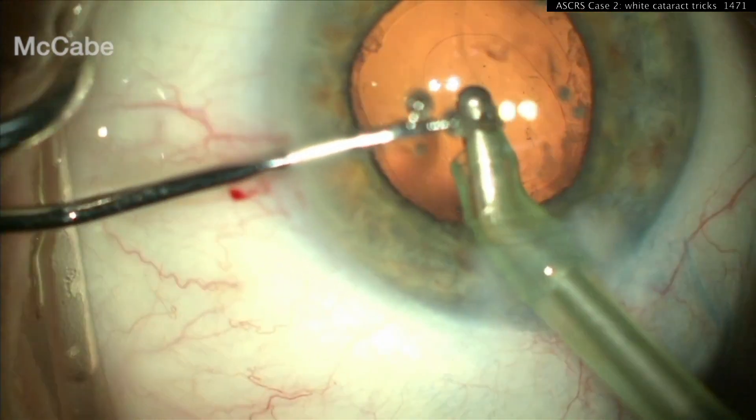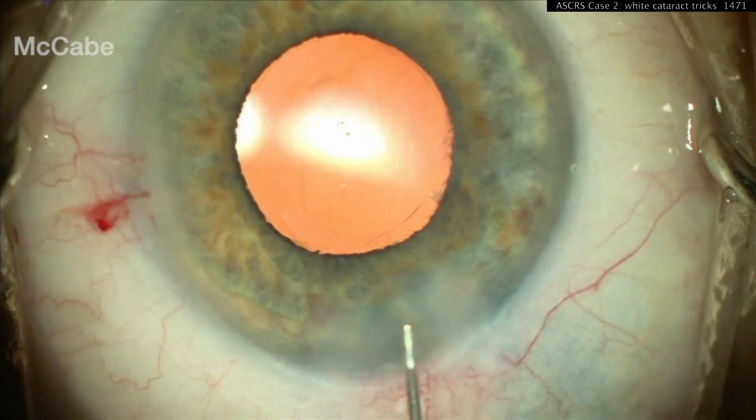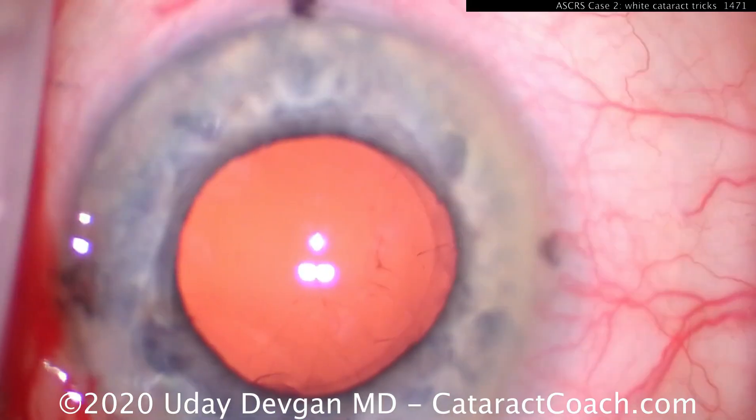So let's try and see if we can do that for my case. At the end, look at that double rhexis — you see the anterior capsulorrhexis and there's the posterior one. The patient doesn't even need a YAG capsulotomy now.